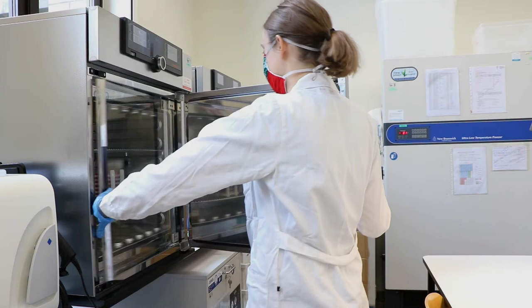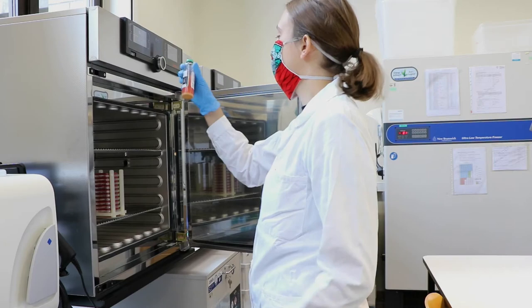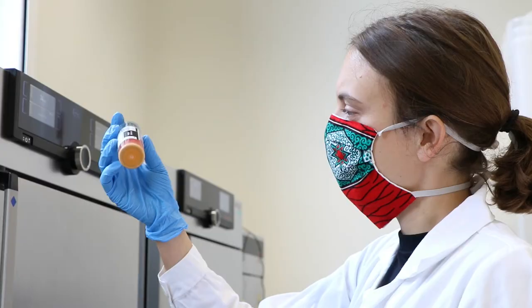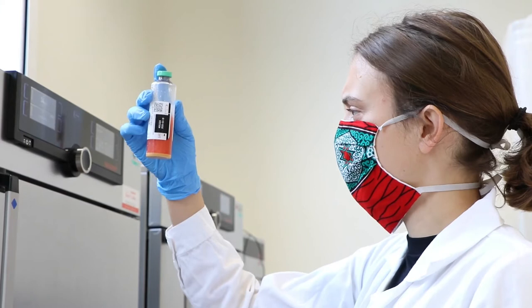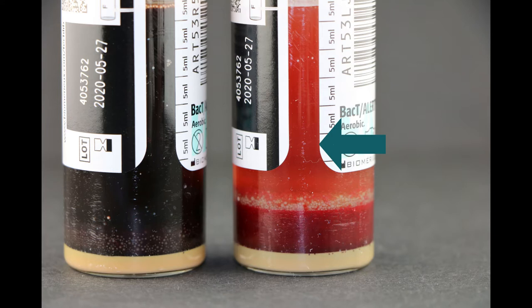In the conventional incubator, blood cultures are incubated for 7 days. Signs of growth are checked at regular time points of the day. During the first 3 days, we check every morning and evening. During the remaining 4 days, we check every morning.